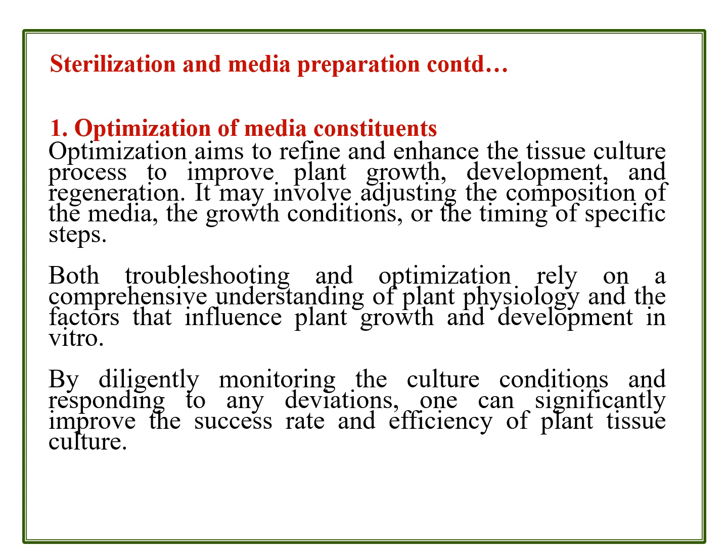Of course, after sterilization of the media, by either physical, chemical or filter sterilization, the heat labile, that is heat sensitive molecules, such as growth regulators, will be added at room temperature. Next, troubleshooting and optimization generally depend on a comprehensive understanding of plant physiology and the factors that influence plant growth and development in in vitro conditions.